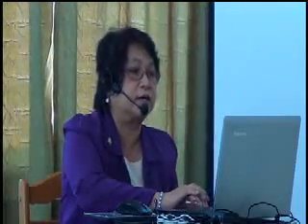The next slide will show you, remember those strips that I've shown you earlier, you can either see it with your naked eye, or you can use something high-tech. Well, it's not really high-tech. Some companies in the States, the kit will come along with a reader. So you can see here, AccuReader, AccuScan. So you can quantitate it. It's not only by looking qualitatively, but you can also quantitate how much contamination you have in your food. Or you can also have the goggles or the lenses if you want to be high tech, but you don't need to. You can see it actually with your naked eye.